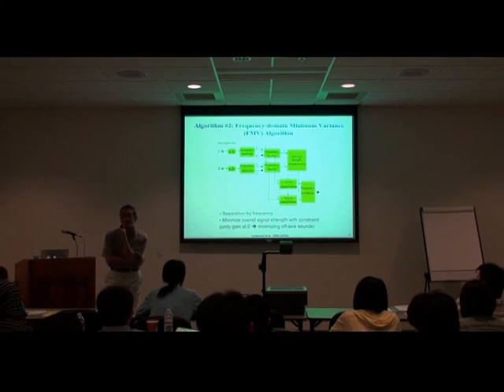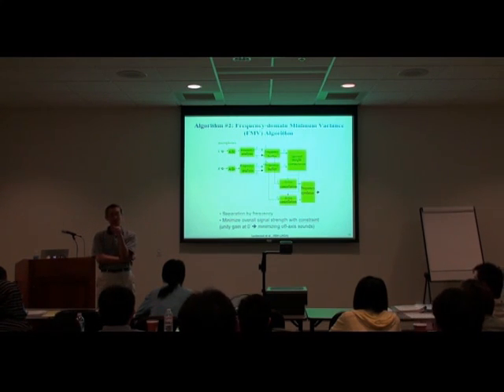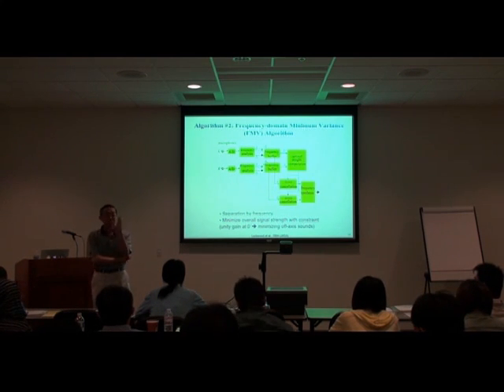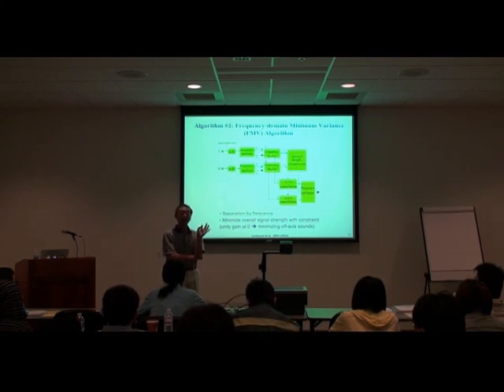So again, let's go back to the biology. We can focus on sound coming from any angle. At any one time, only one sound. So we can focus on 0 degrees or 20 degrees. But for people who are hearing impaired, what do they do when they can't understand what they hear?